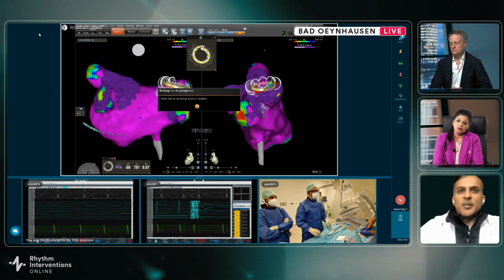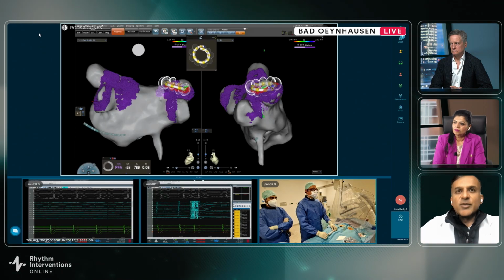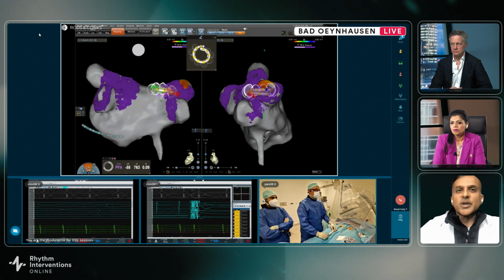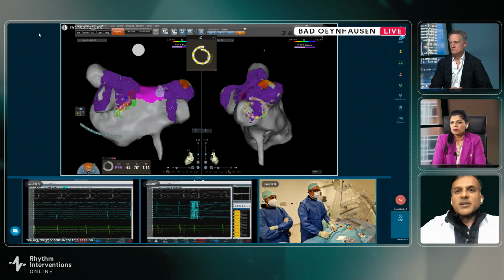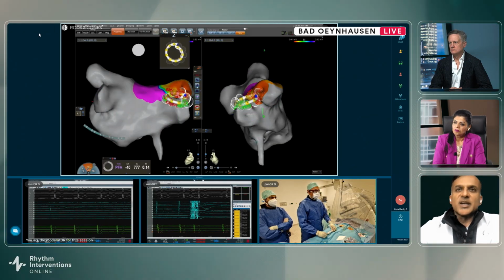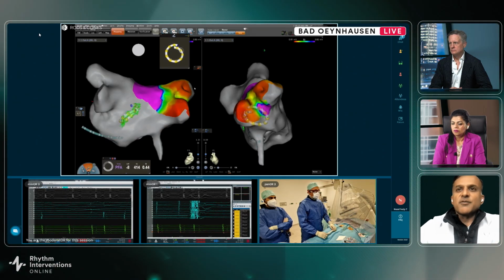So when we come on ablation, we have to manually turn it to 30 cc's every time, and then when that series of 3 applications is completed, we go back to 4. From a physics standpoint it seemed like it had some good reasoning for it.